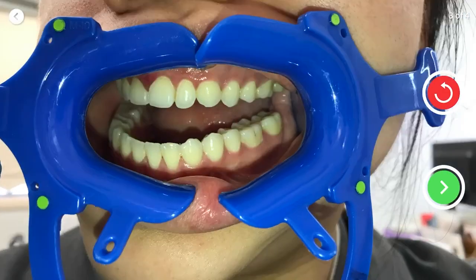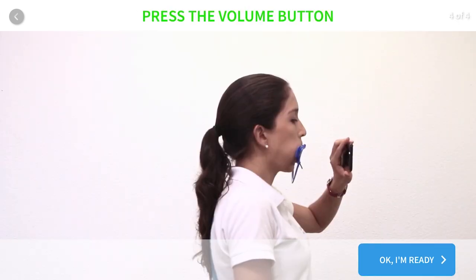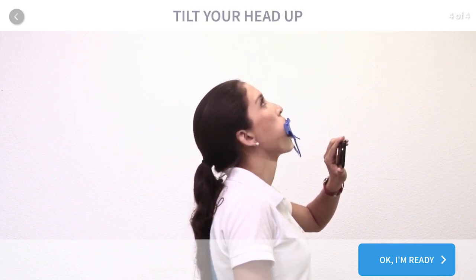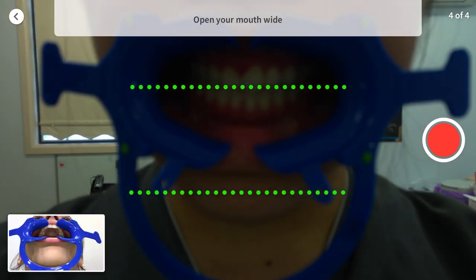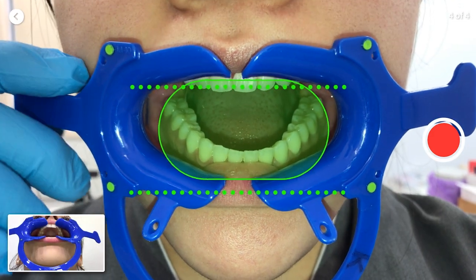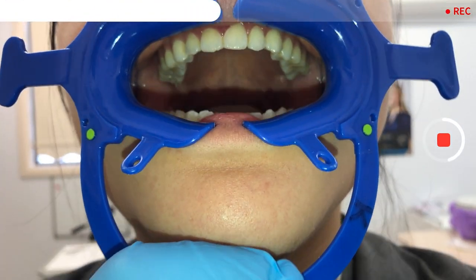Once completed, move on to your final scan. Click OK and ready to begin the last scan. Open your mouth wide, about two finger spaces, aligning with the upper and lower green dotted lines. Once you've aligned both upper and lower, press the volume button to start. Slowly tilt your head up, then slowly tilt it down to complete your scan.